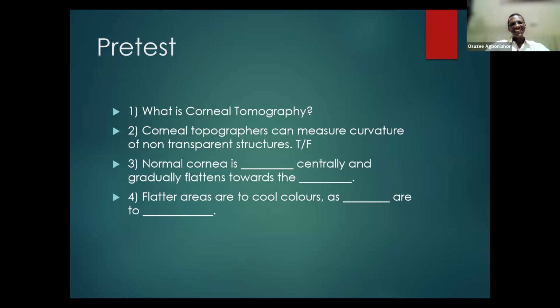All right, so question 1 there, I deliberately put it there because I know we already used corneal topography, since it's the corneal topography module we're talking about. I deliberately put that there to confuse us. I'm not surprised that some of us fell into that trap.